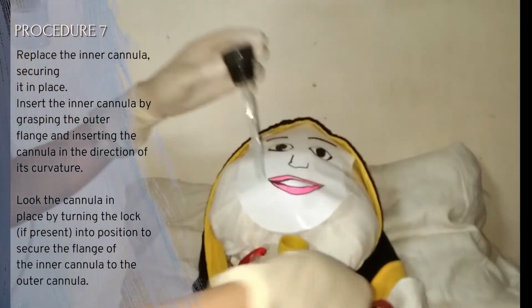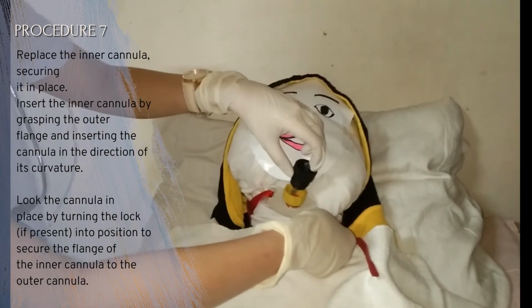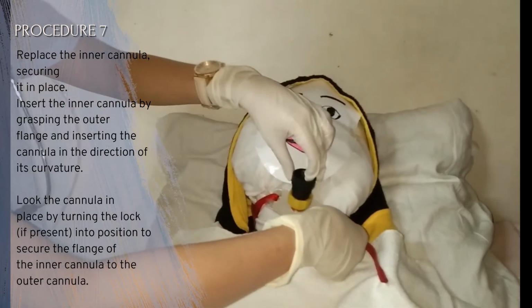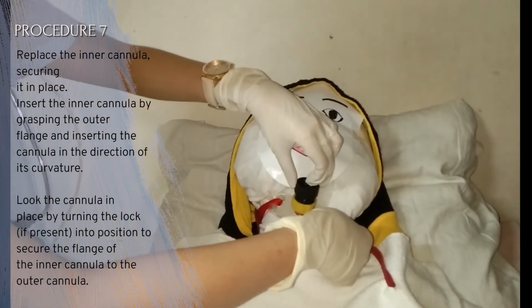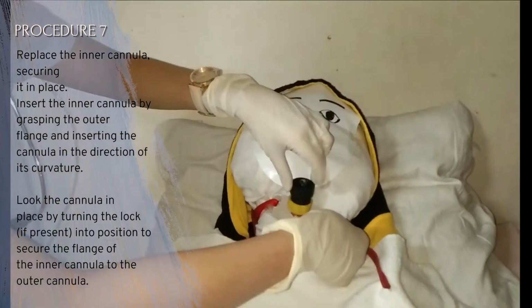Replace the inner cannula and secure it in place. Insert the inner cannula by grasping the outer flange and inserting the cannula in the direction of its curvature. This prevents trauma to the tracheal stoma. Lock the cannula in place by turning the lock into position to secure the flange of the inner cannula to the outer cannula. Oxygen is re-established to a secured inner cannula.